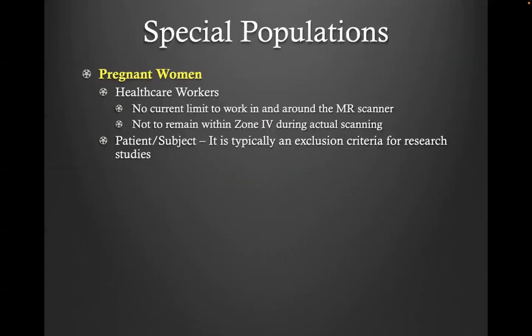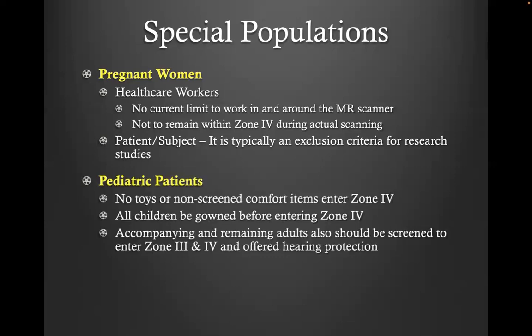For some other special considerations, there are pregnant women. For healthcare workers, likely you who are staff working here, there's currently no limit to work in and around the MRI scanner, but you should avoid being inside the MRI scanner room when active scanning is going on. You should just be outside of the scanner room. For patients and subjects, pregnancy is typically an exclusion criterion for research studies, so that's usually not a question to be asked.